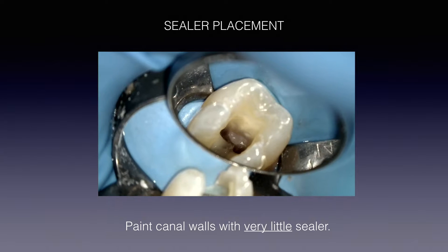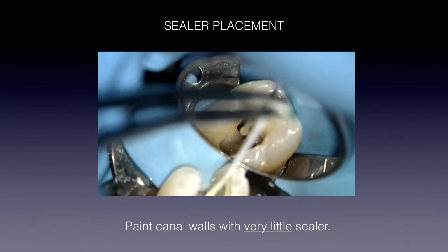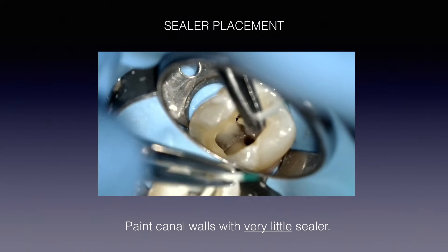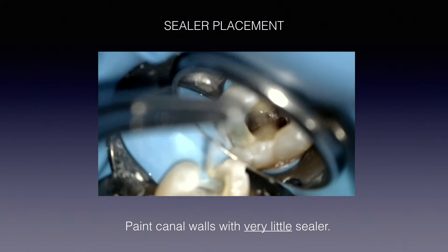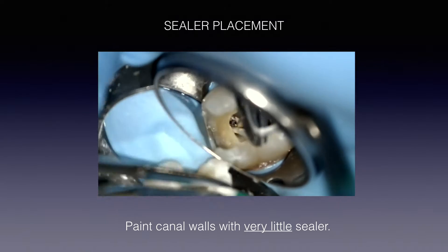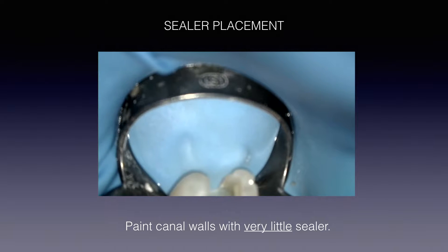At this point when you're putting in your sealer, if you're new to using the gutta core system, this is a nice little point to mentally start thinking about — imagine this as being your gutta core. It's almost like a rehearsal for placing the gutta core inside the canals. Remember, you're going to put in that paper point, just brush the walls gently with very little sealer. You're not touching the walls of the endo access. That's all you need to do when it comes to obturating — just a little bit of sealer to act as a lubricant. Now we're going to put our carrier-based obturation, the gutta core, in the oven.